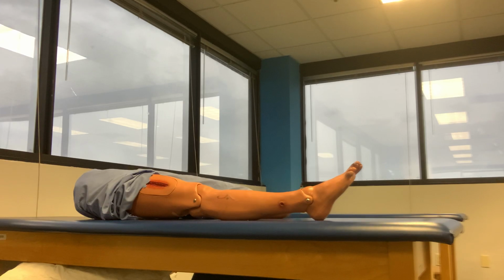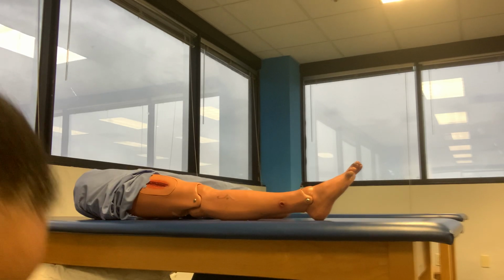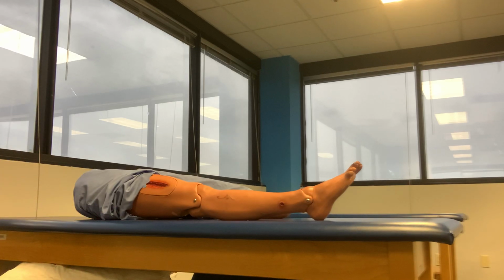So the patient would be over in the waiting area. We would take their blood pressure and go ahead and set up or get our area ready to bring our patient back. One of the first things you're going to do, at least for the skills check, is introduce the call bell to the patient when you give all the information, when you're taking the blood pressure and explaining the procedure to your patient.